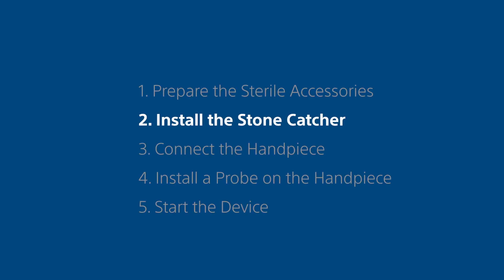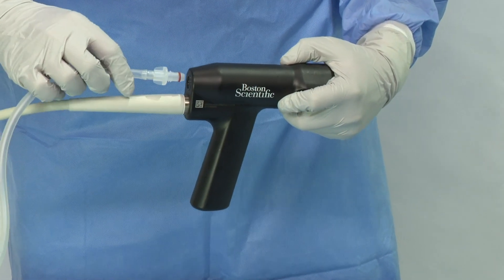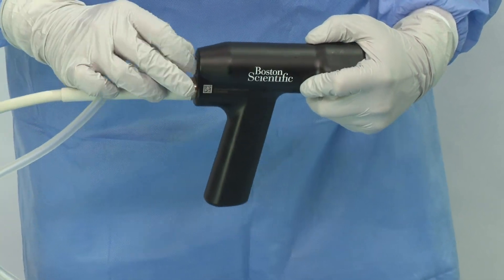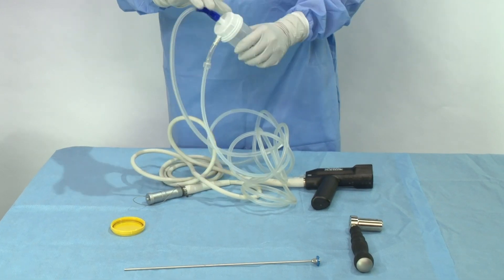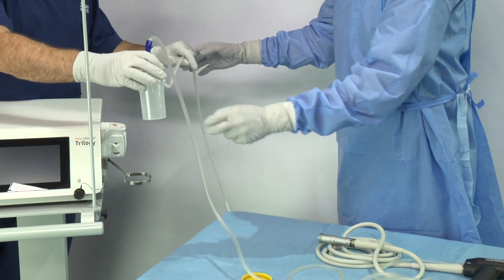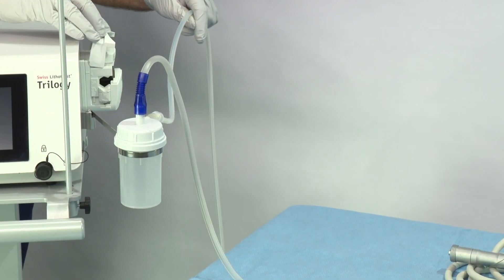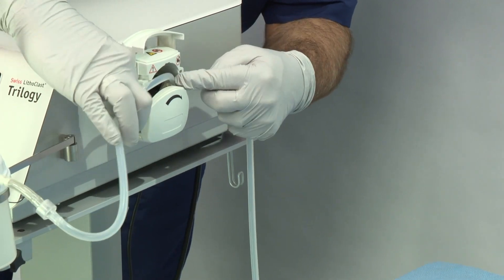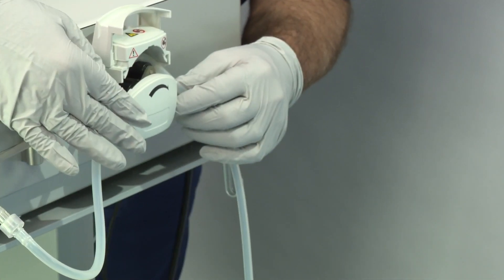Step 2. Install the stone catcher. Screw the sterile connector of the stone catcher into the handpiece. Tighten the stone catcher lid. Insert the stone catcher into the stone catcher holder and open the pump. Place the stone catcher output tube into the pump.